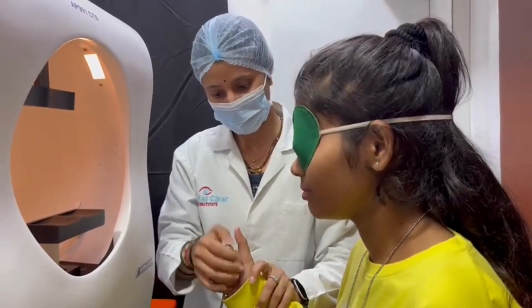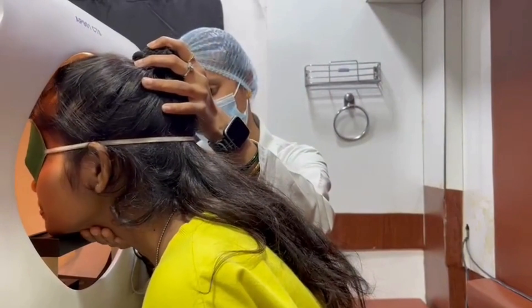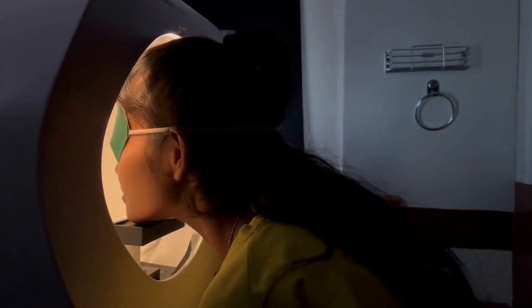If you wish to take a break at any point during the exam, hold the response button down to alert the technician. If you have any questions or concerns, please do not hesitate to present them to the technician before the exam begins.